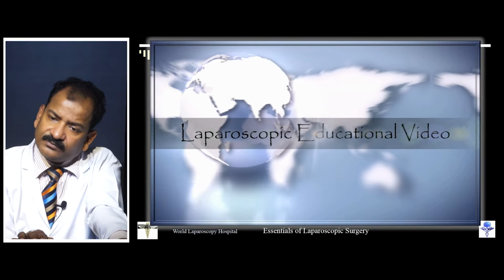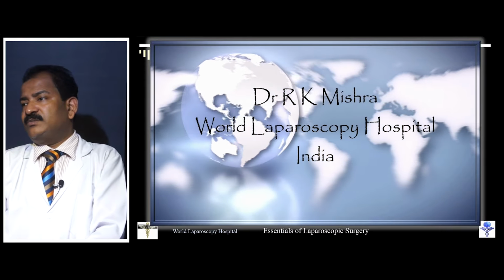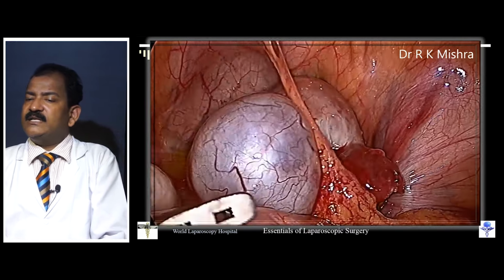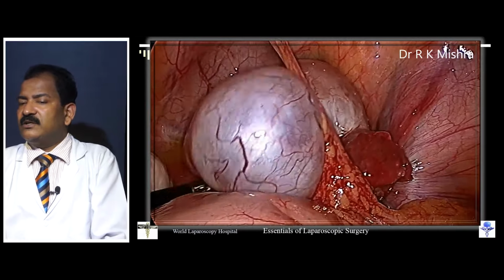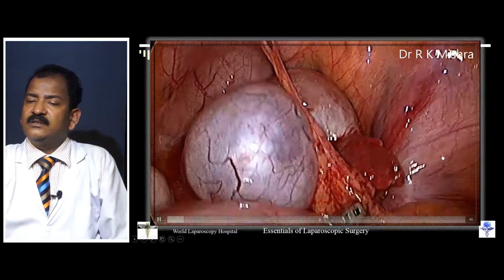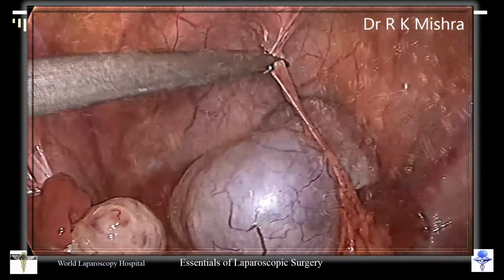Sometimes you have ovarian torsion, that is also a very good surgery. If ovarian torsion patients come, laparoscopy is a good answer. Like here, this patient had a previous cesarean section, and 3 months after the cesarean section, she has ovarian torsion. The reason was adhesion of the uterus with the omentum. The omentum, as you know, is like the police; it does not always do the good thing, many a time it causes more disturbance than benefit.